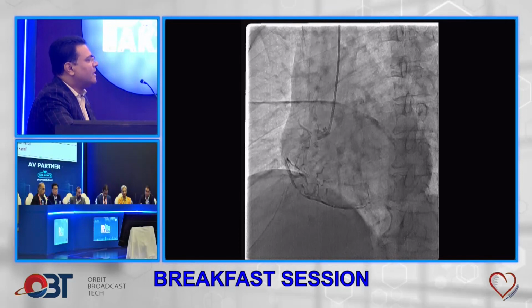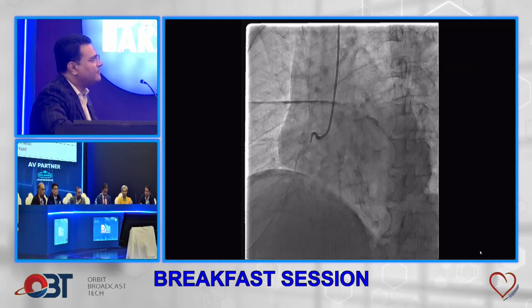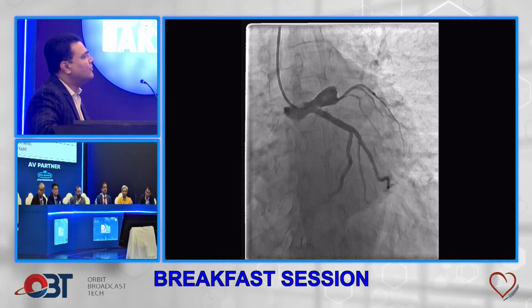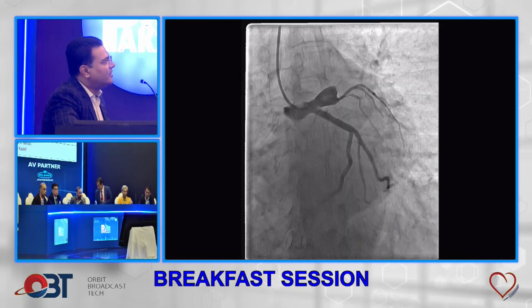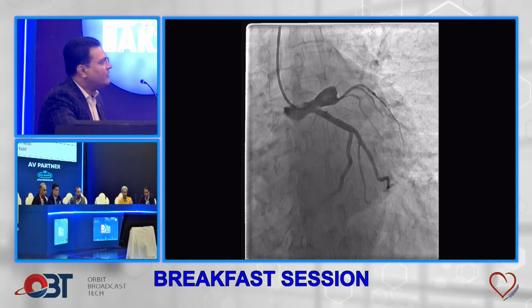So here is the angiogram. Right coronary artery is non-dominant and normal. Left system, LCX is dominant, normal, and there is a huge aneurysm at the ostioproximal LAD. There is a diagonal branch which also shows normal, and a little branch shows evidence of clot. So here shows the mechanism of acute MI, that is the thrombus in the aneurysm of proximal LAD. So the question is open, how will we do next?